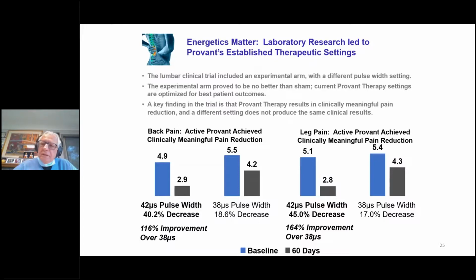So I guess the lesson here is that energetics are important. They really do matter. And how the waveform is constructed, how it's delivered, how it's engineered. I thought about it the last couple of weeks as I was preparing for this presentation, and kind of combined some of the research out there with my personal experience.